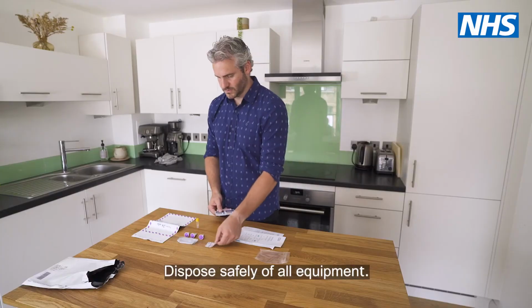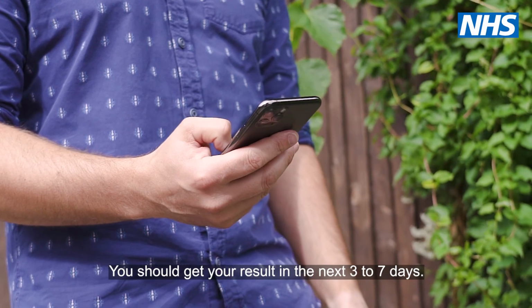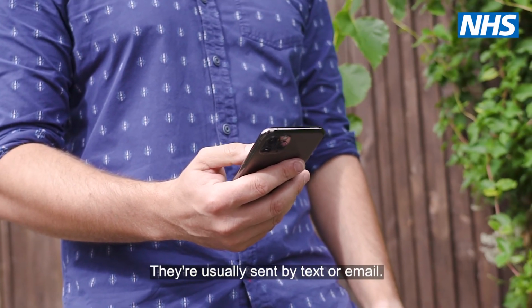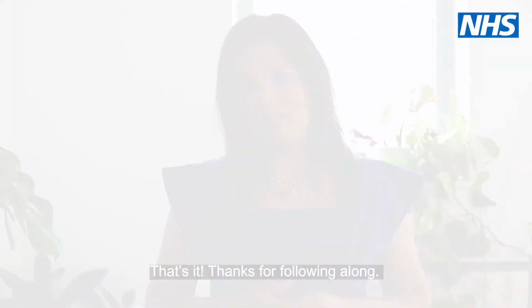Dispose safely of all equipment. You should get your results in the next 3 to 7 days. They are usually sent by text or email. That's it. Thank you for following along.